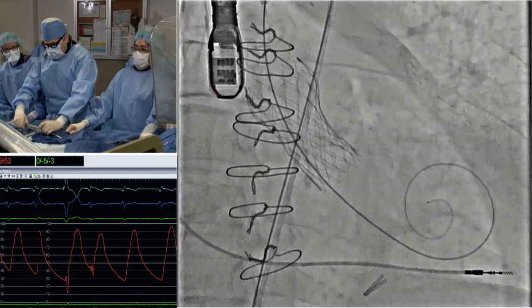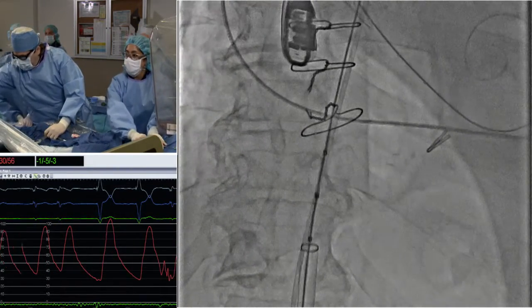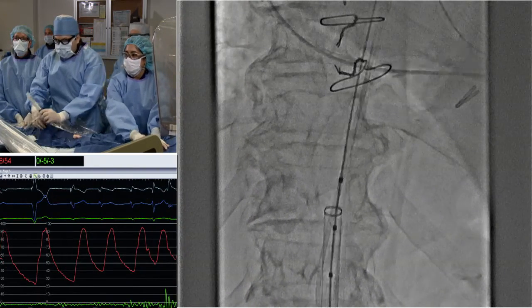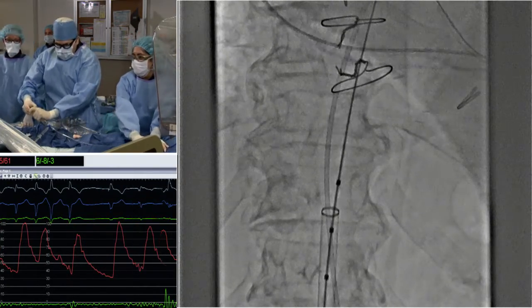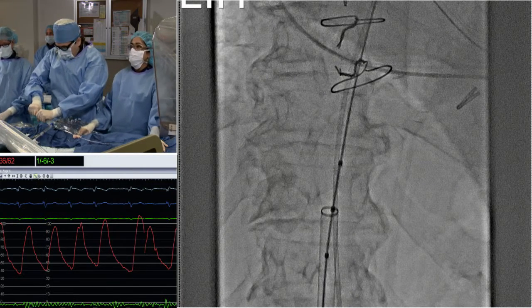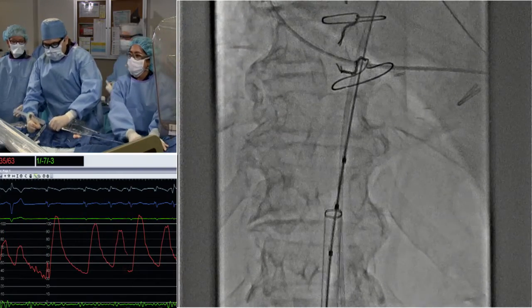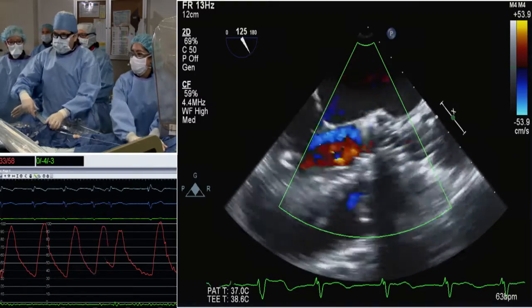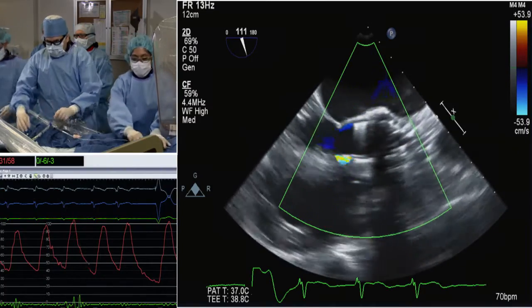So still no AV block, I guess. Oui, juste montre pas le ballon. Il rentre. Ouais, là, c'est bon, reste ici. No, still no AV block. Okay, wait. I just added some more negative suction on it. So Patrick, if you want to just describe what you see. I'm just looking around. Can we see the echo, please? Okay, thank you. It's really weird. Okay, attends. So you're live.